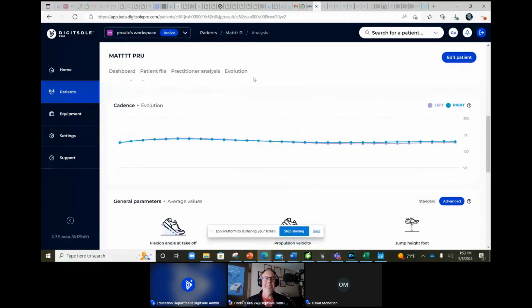So we can't do that just yet. You would actually have to take a screenshot, which I can do on the computer or on my mobile. So you can play the video to the point where you want to stop, and then take a screenshot on your system or on your mobile device. You cannot attach that to your PDF export yet, so you would have to send that as a separate file at the moment.